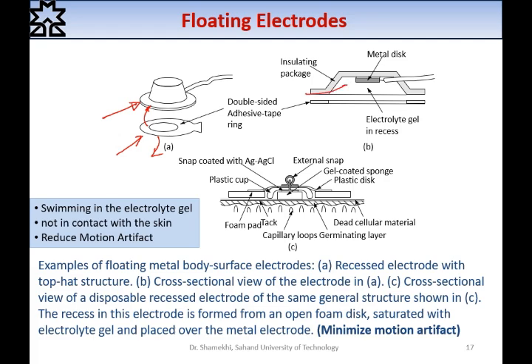And inside it, we fill electrolyte, and here the metal disc will record the signals from the body. In other words, the metal disc is swimming in the electrolyte gel, also not in contact with the skin, and this reduces the motion artifact.